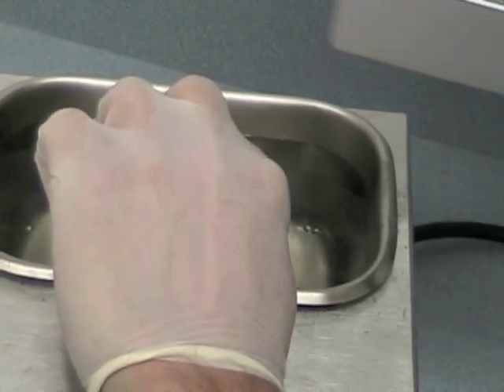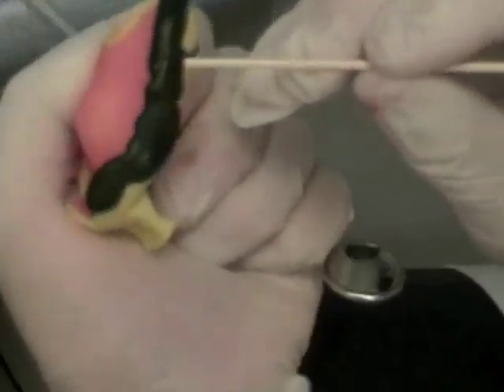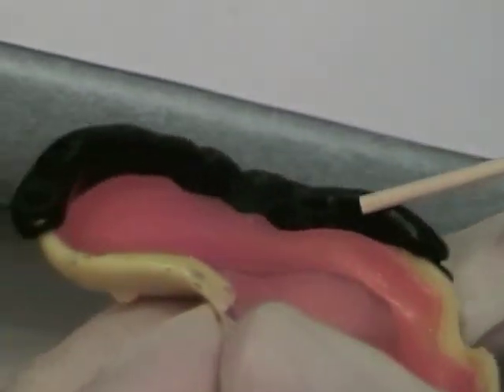Temper in the water bath before you reinsert the custom tray. After molding, remove the compound and check to make sure there are no seams and also that you've got the tissue detail such as the phrenal attachments and that you have a matte finish.